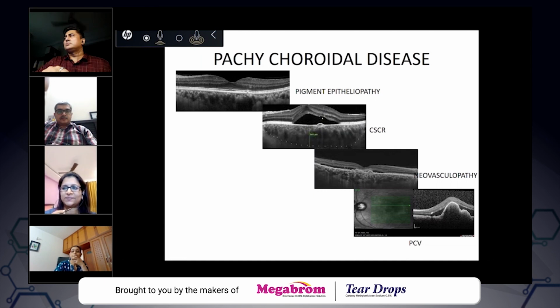Okay, sir. Whether the test dose is intradermal or subcutaneous? Here we give intradermal, just before the FA. Okay. So there's one question in the chat box: how to differentiate a CNV and pachychoroid neovasculopathy on OCT?